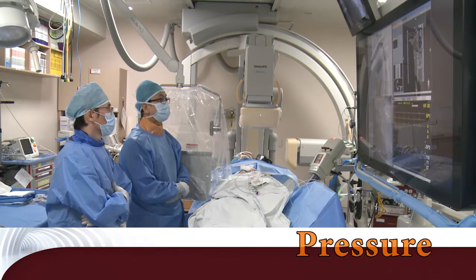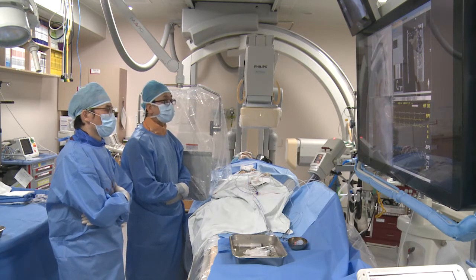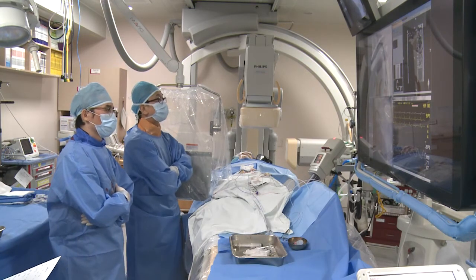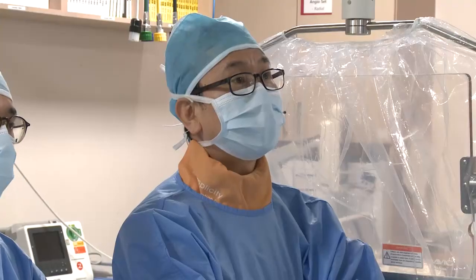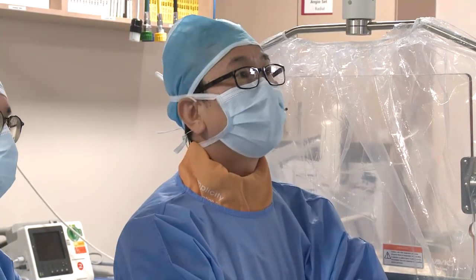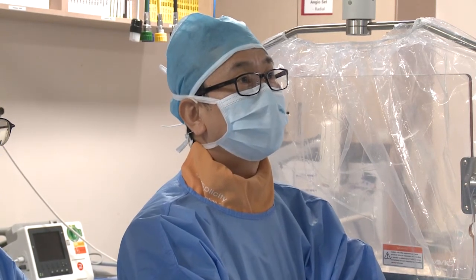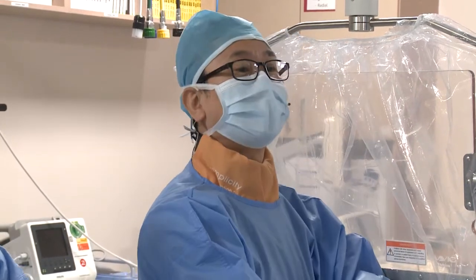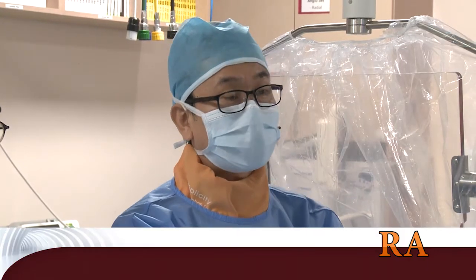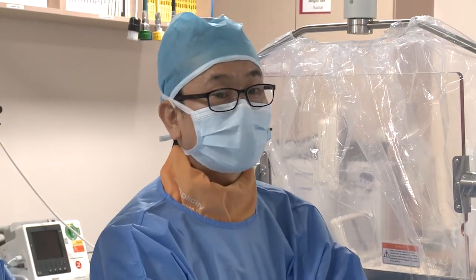Our RV pressure is now 72 and the aortic pressure is 110, so it's about three quarters — approximately 75%. Today we checked the pulmonary pressure: LPA distal was 15, mean 10. On the proximal part, the PA pressure was 56 over 30. So there may be stenosis on the vessel. We will check the rotational angiogram and find out the stenotic vessels.